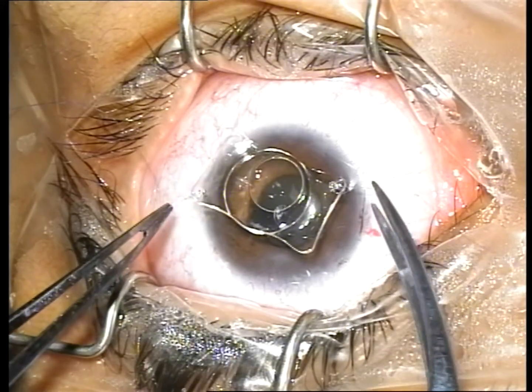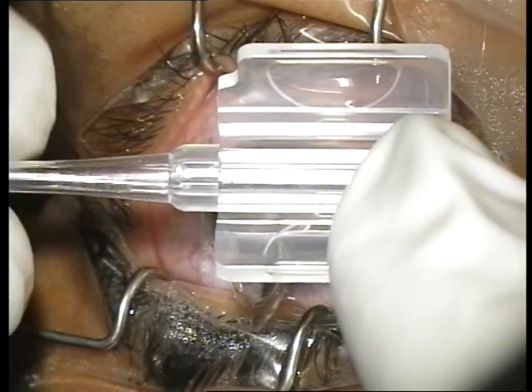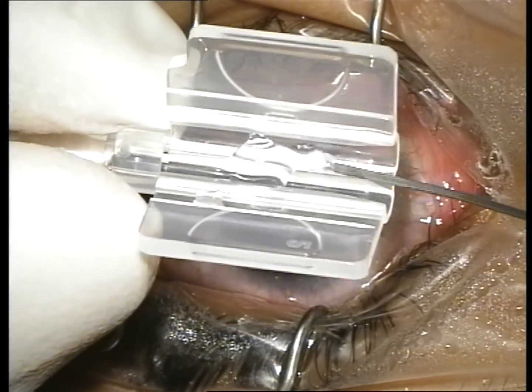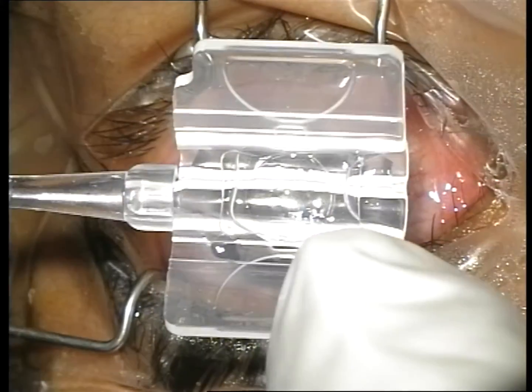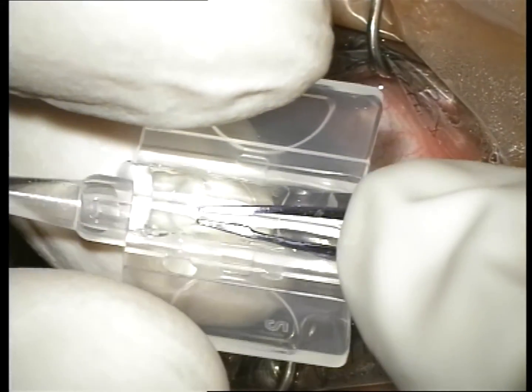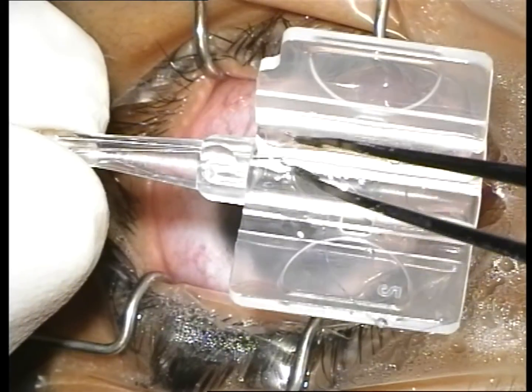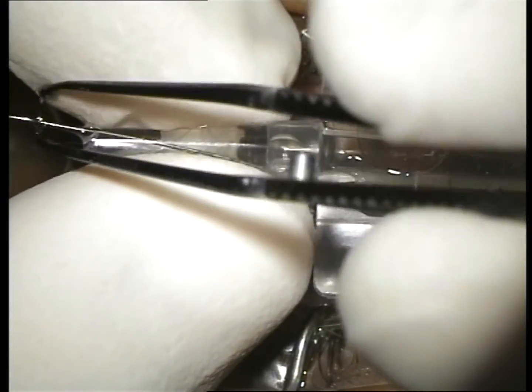The same procedure is repeated with the trailing haptic. Two needles extending from the leading haptic are passed through the tip of the IOL cartridge. The cartridge is filled with viscoelastic material. The IOL is then inserted into the cartridge and the two needles extending from the trailing haptic are passed through the tip of the cartridge.